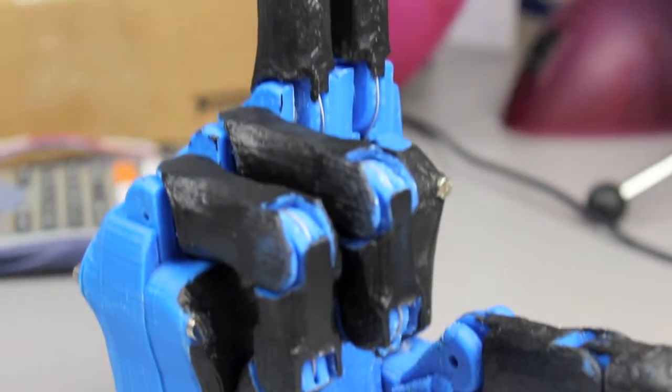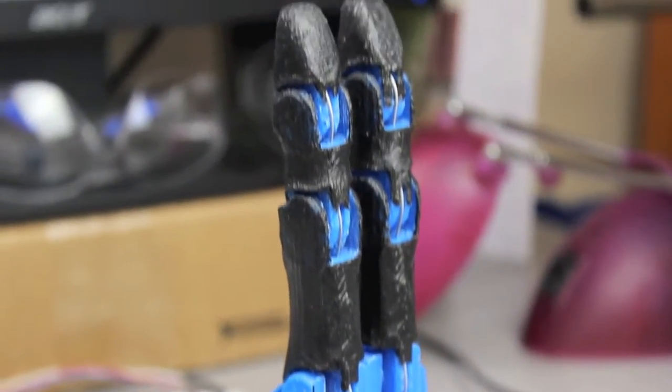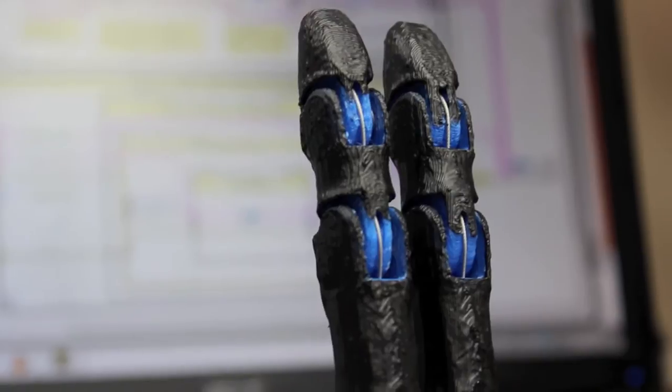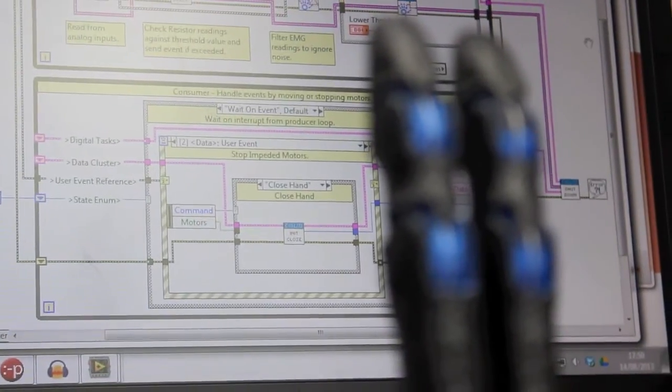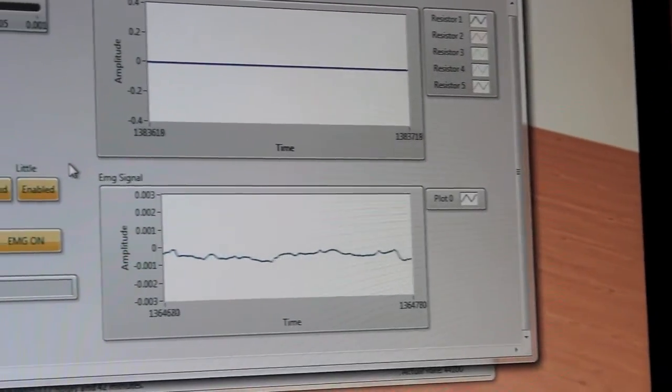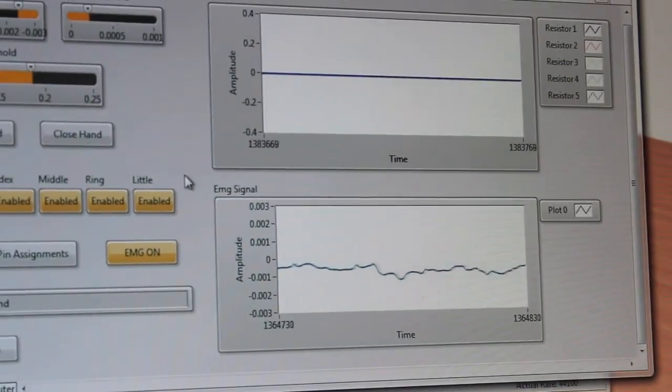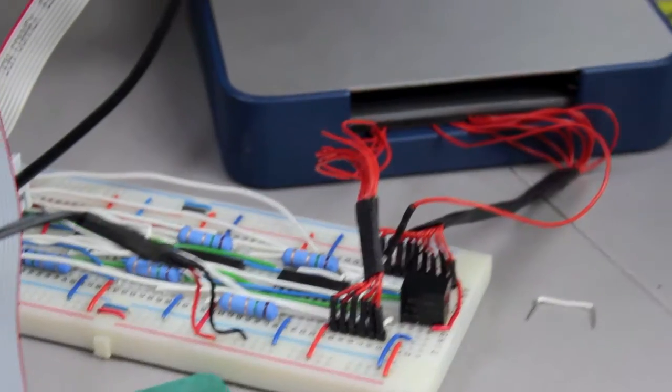The black coating that you can see on the hand is PlastiDip, which is like a rubbery coating which gives the hand a better grip. And it connects up to LabVIEW software through a National Instruments data acquisition device just as before.